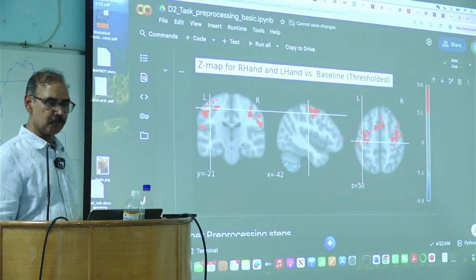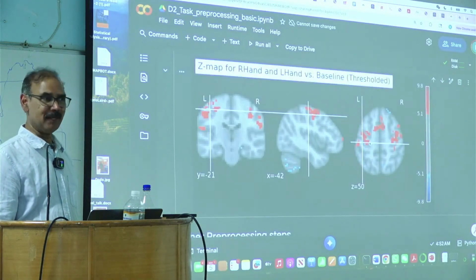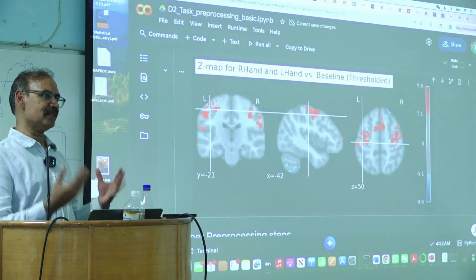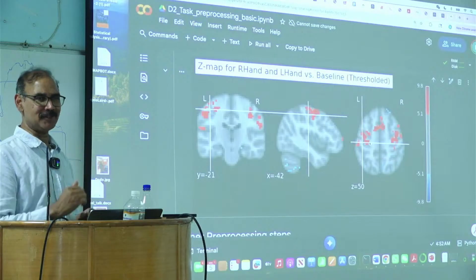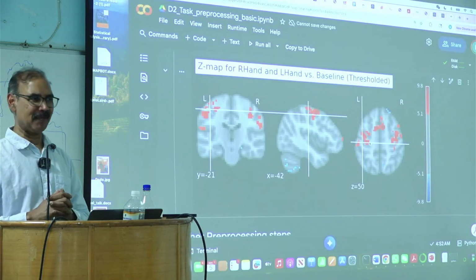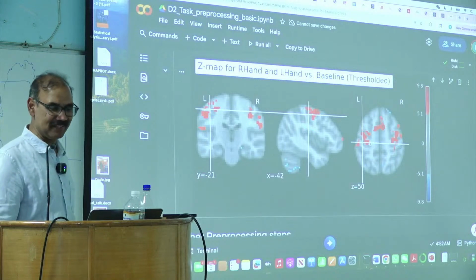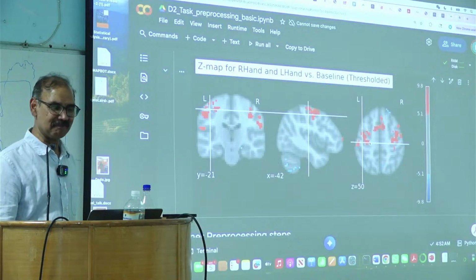Okay, so again, this is one of the challenges in neuroimaging. If anyone can find an automated way that, okay, for this data set, this should be the optimal threshold, I'm pretty sure, and if people start following your paper, you can easily have many more citations. The paper would be cited thousands of times.